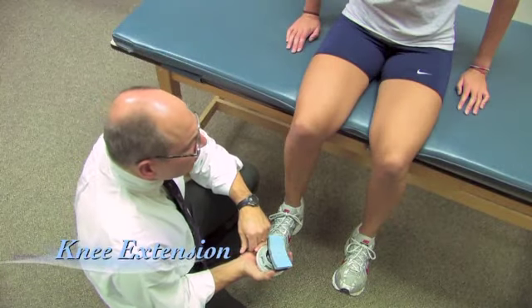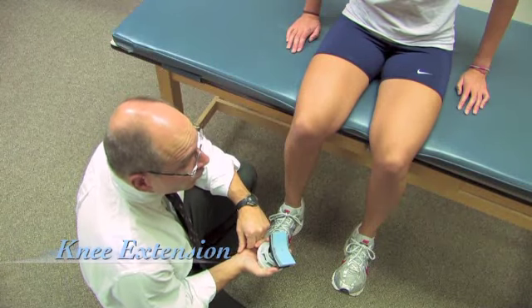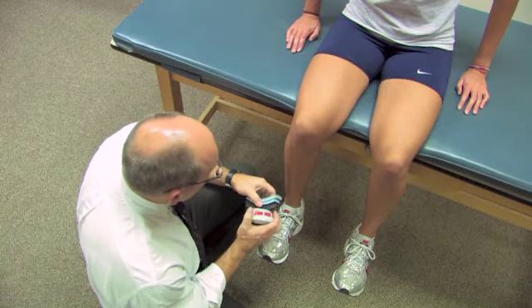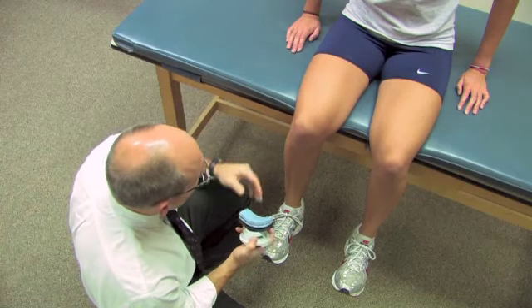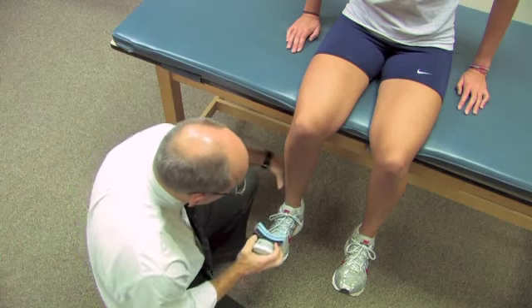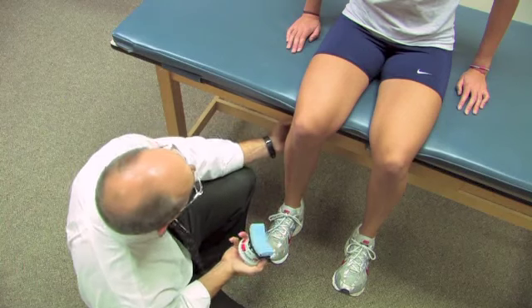Now we're going to measure knee extension. Very often when this is being done, there would need to be an additional individual here to help hold the person being tested down. But what we're going to do in this case is leave the leg hanging freely so it's at about 90 degrees. I'm going to take the dynamometer and place it just proximal to her lateral and medial malleoli here.